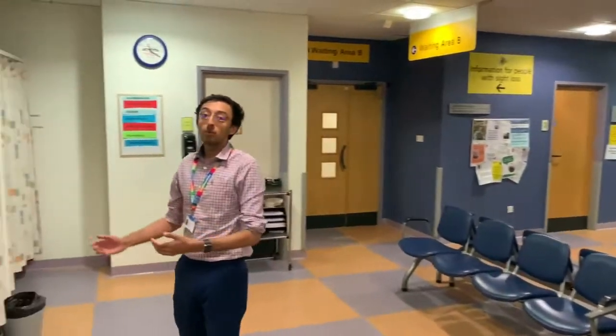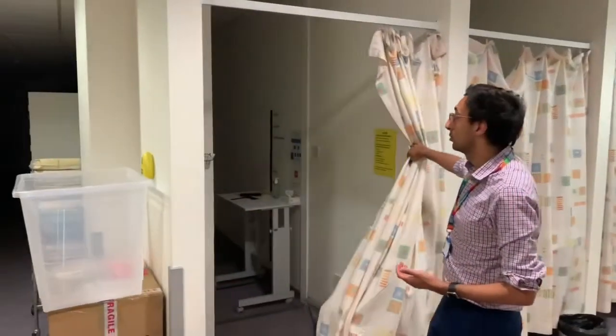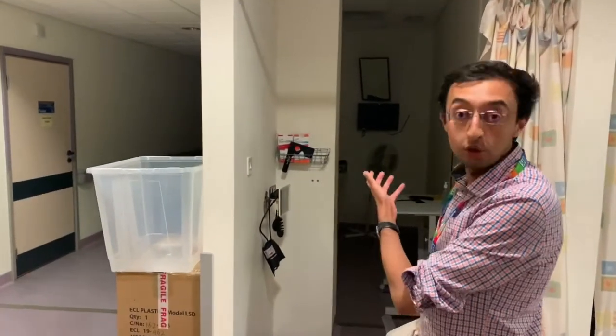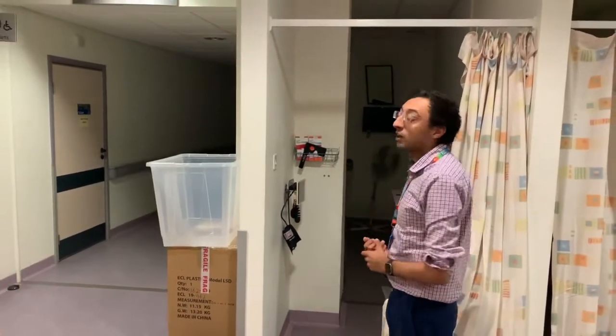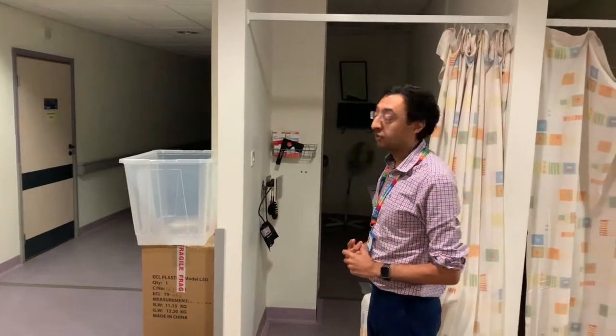Behind you here, we have our vision lanes, and we measure the vision using logMAR, 2 decimal places, for every patient, not just our medical retina patients, and this is using the Thomson visual acuity record screens. If needed, we can dilate our patients. We always usually dilate the patients with tropicamide and phenylephrine together.